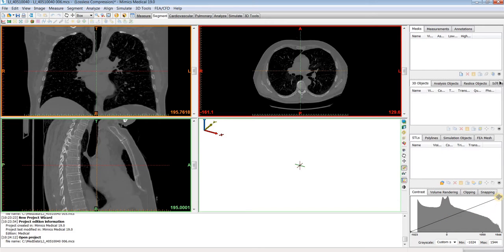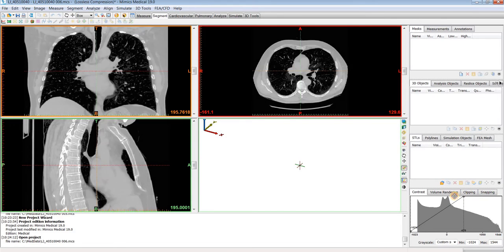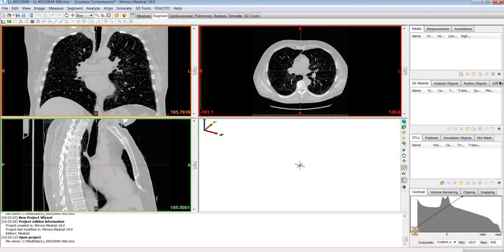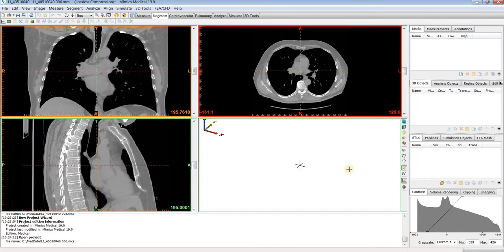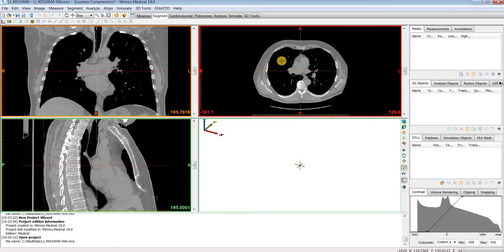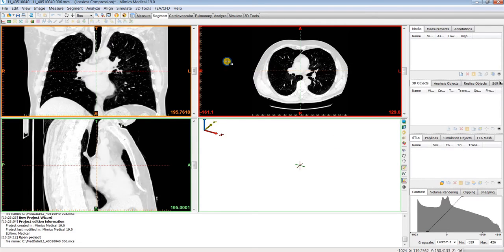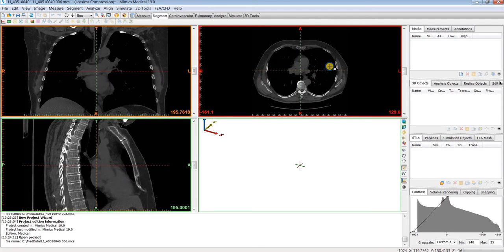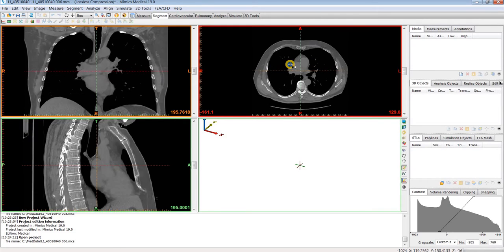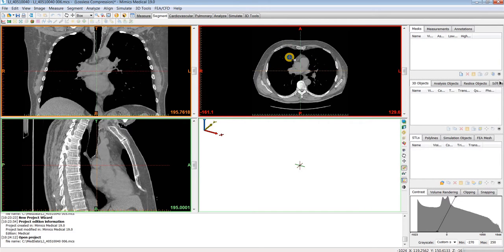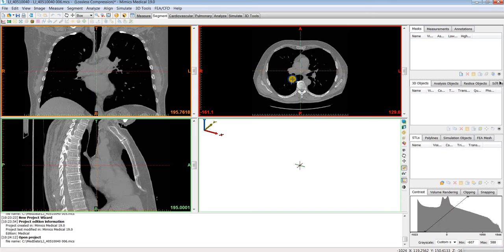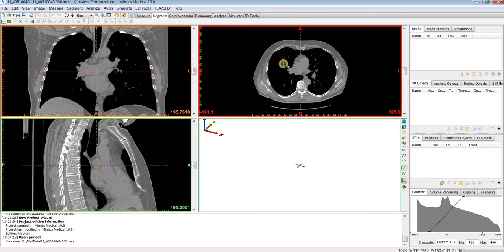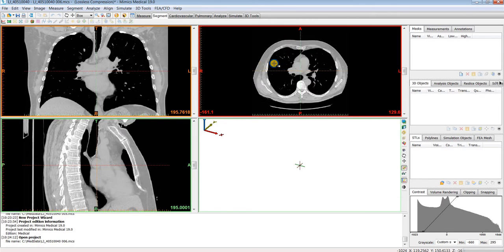We can use the contrast tab to adjust the windowing of our images by dragging these points around. Alternatively, you can also hold down right click and drag your mouse left to right to change the brightness of your images, or you could drag your mouse up and down to change the contrast windowing for your images.